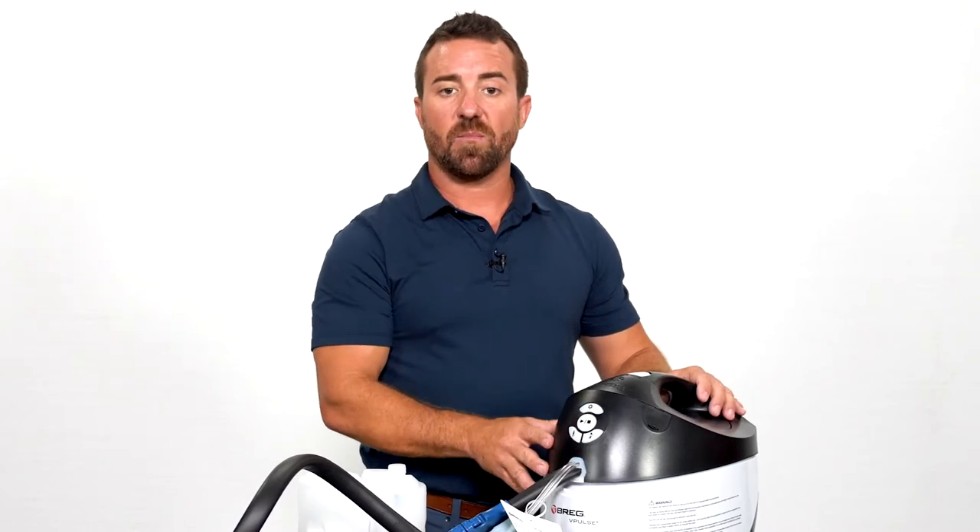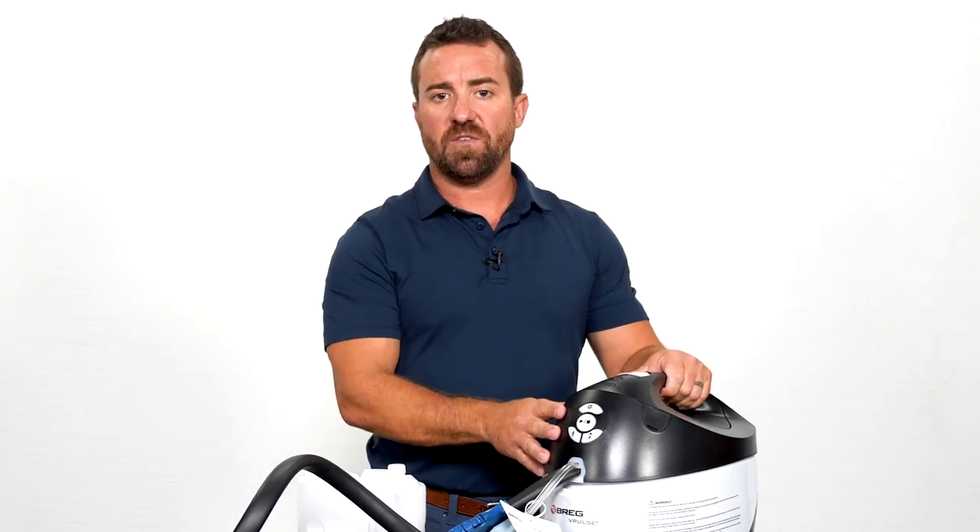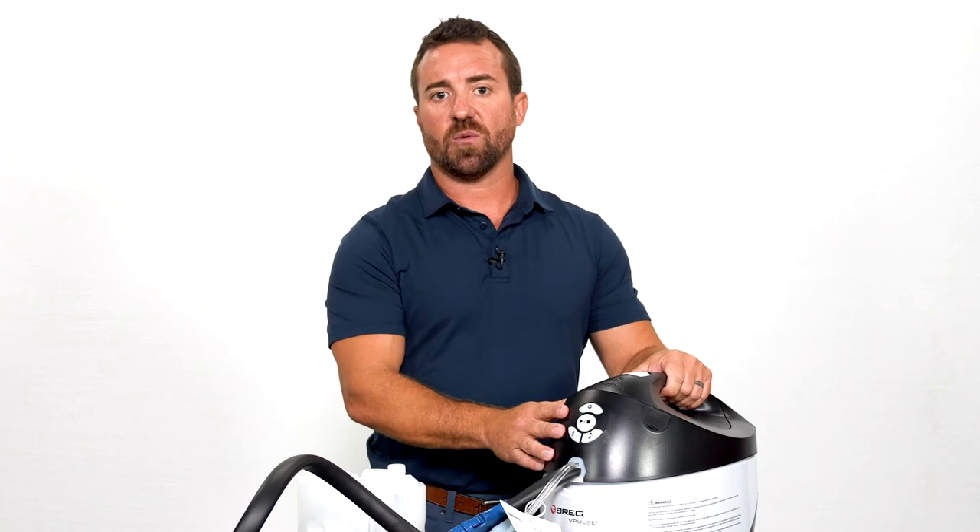The machine will run until you press the stop button to end treatment. Please follow your doctor's guidelines on use and time of use for the DVT prevention and the cold and compression.